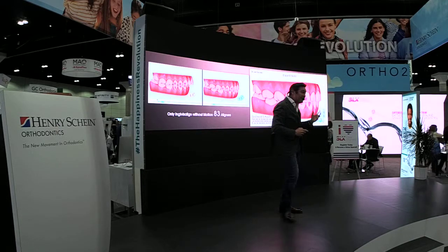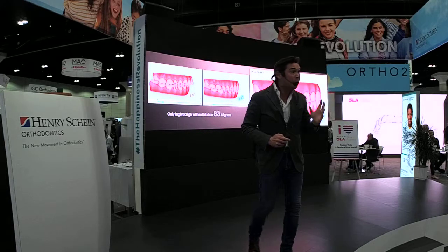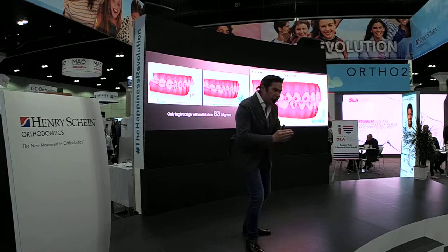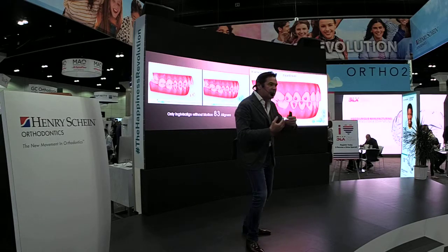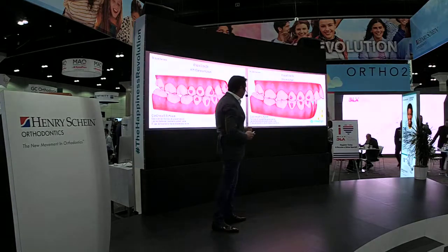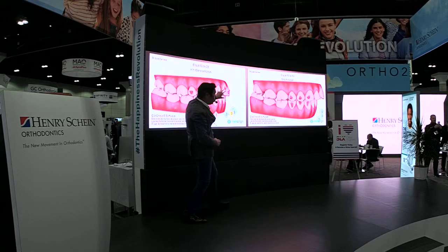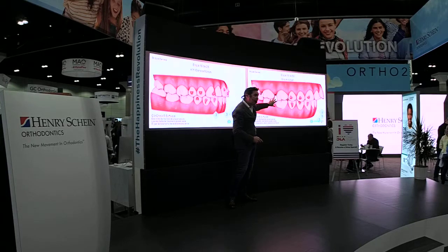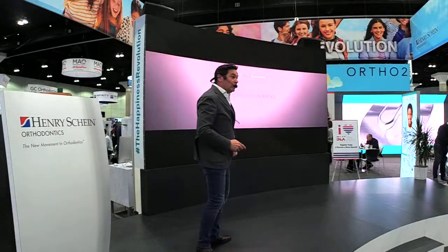So imagine that these 83 aligners were focusing the attention on dental. And orthodontic treatment is not dental. Orthodontic treatment is facial, is functional, is airway, is temporomandibular joint, is occlusal, of course, and all those aspects. So look at the difference with the class 1 accomplished with the motion, or moving the posterior segments one after the other and generating a chronic problem of the temporomandibular joint. Those are the differences that we're talking about.